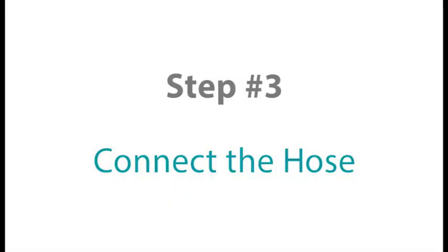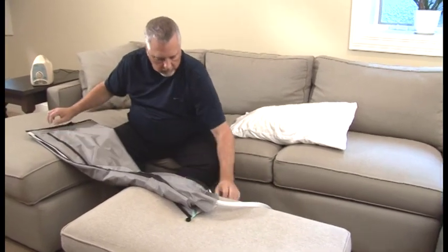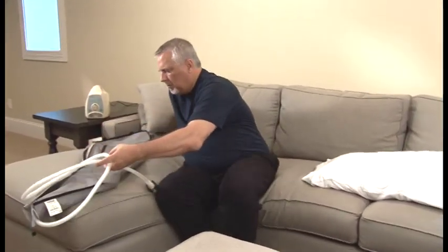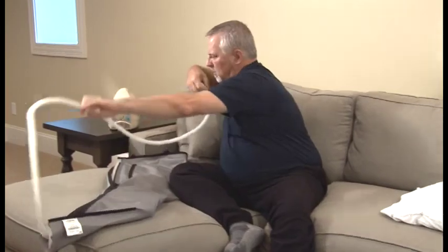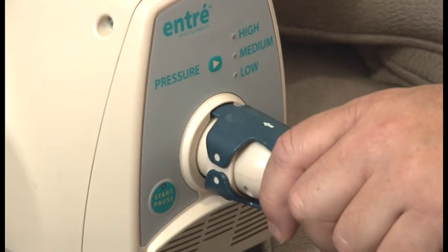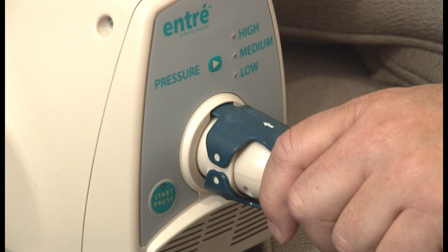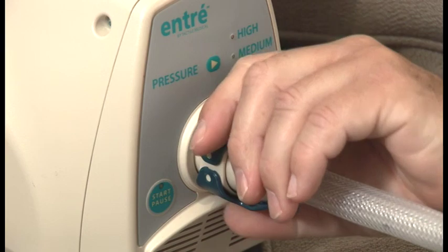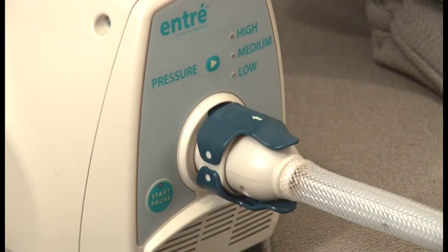Step number three. Connect the garment hose to the ENTRE controller. Garments should be connected to the controller unit before they are applied to your body. If you are treating one extremity, known as unilateral therapy, connect the garment connector to the front of the controller unit. Hold the hose connector by the latch ramp, making sure the arrow is facing up. Align the latch with the notch on the controller port and push the latch forward so it hooks at the bottom, then push the connector so the top latch snaps into place. You should hear the connector latch click twice if attached properly.